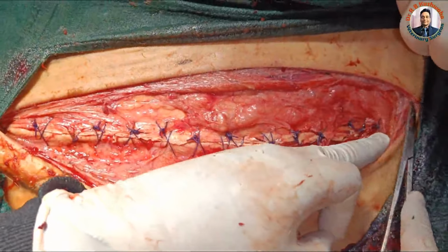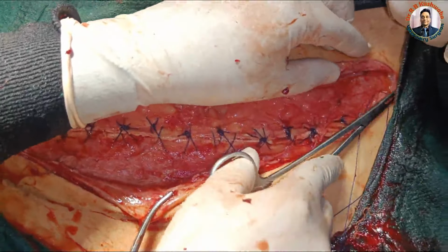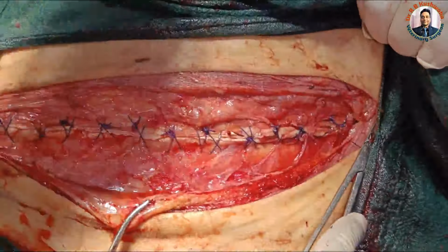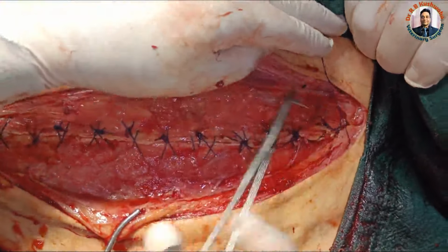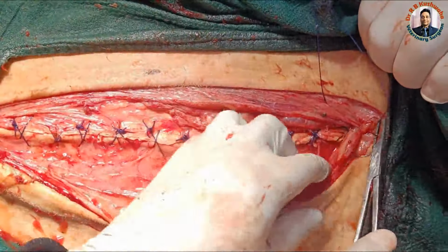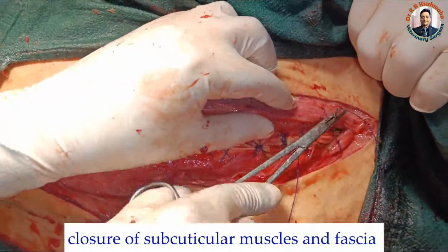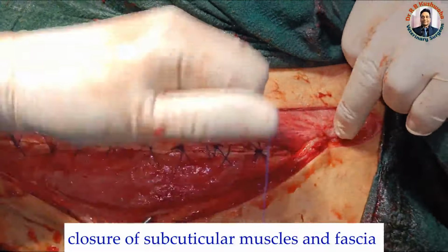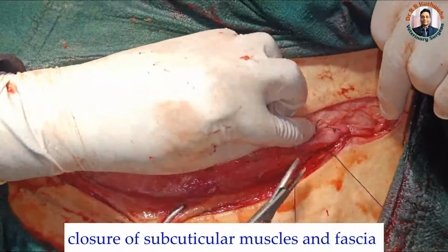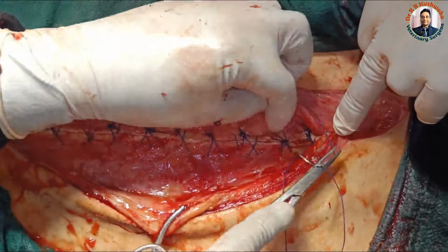So now we are going to repair this second layer. So we also take the bite in the underneath layer, that is the aponeurotic part, just to obliterate the dead space. So like this. We should not hurry in closure of this laparotomy incision in the cesarean section in cattle and buffalo, particularly if the case is not good. Otherwise, there will be dehiscence of the sutures, and ultimately it leads to incisional hernia.